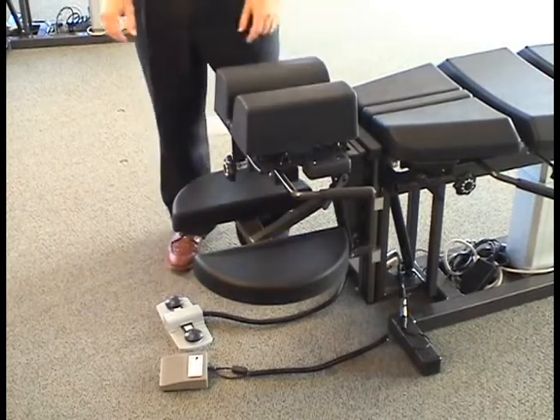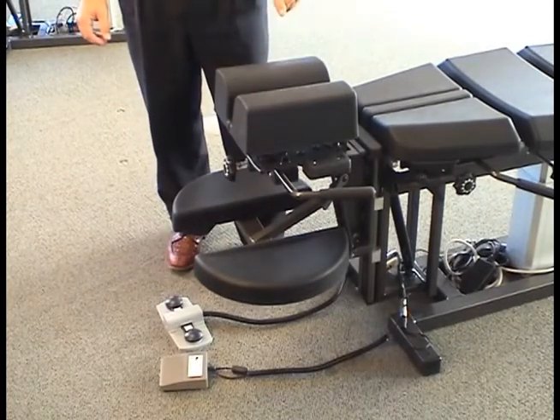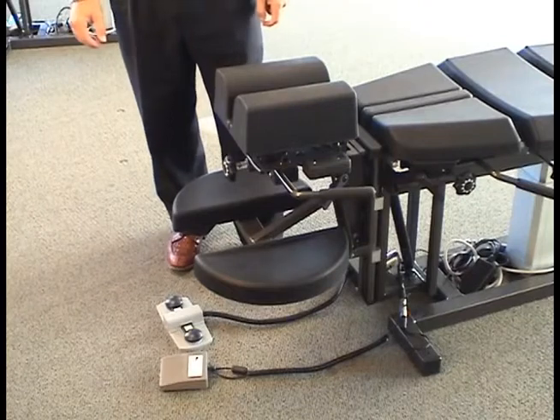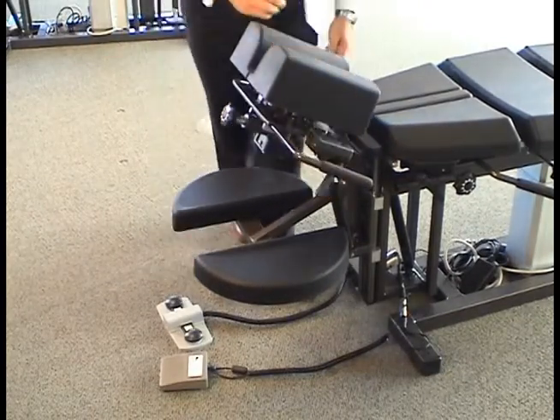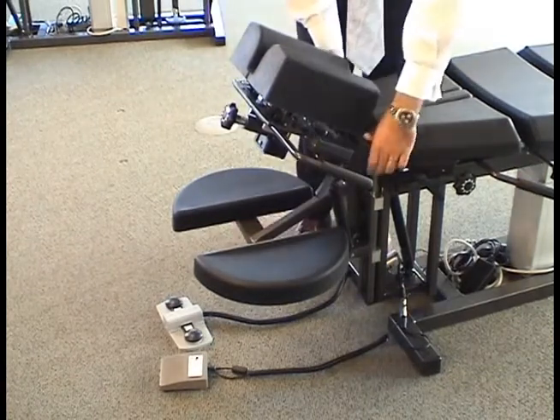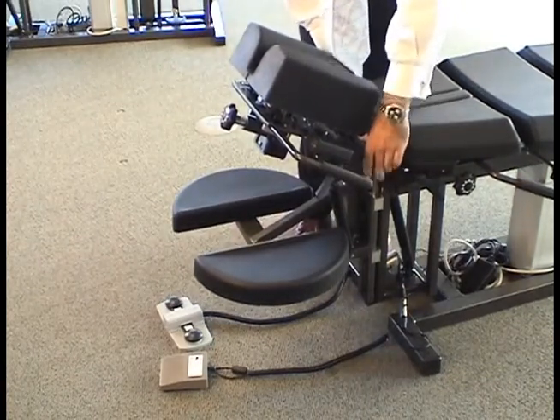To ensure complete function of the headpiece when it is in extension, it is necessary to make sure the cervical instrument adjusting fulcrum is fully depressed.